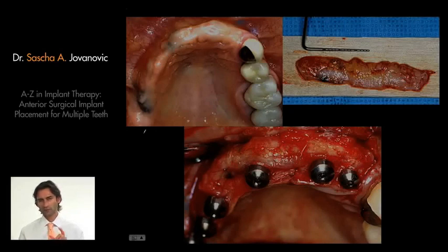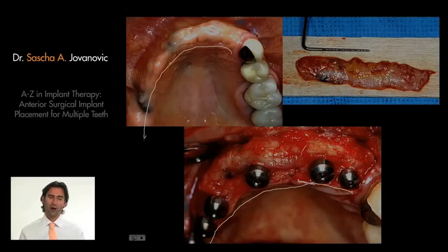This is not too invasive for the patient because I have removed it right here from the palatal area. So it came from the internal part of the palatal flap, right here on the inside of this flap. And I have to open this to expose the implants. So I'm just going to do a thinning procedure to harvest this connective tissue. I'm going to flip it around and place it on the buccal, as you can see right here.